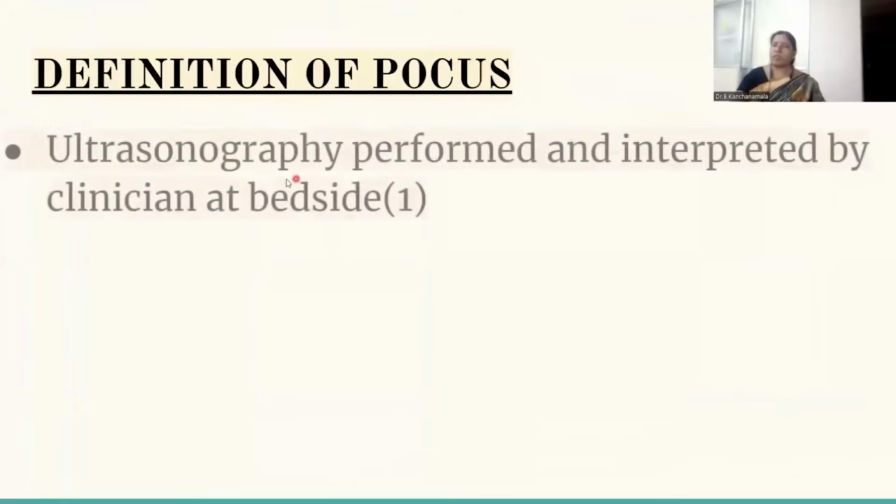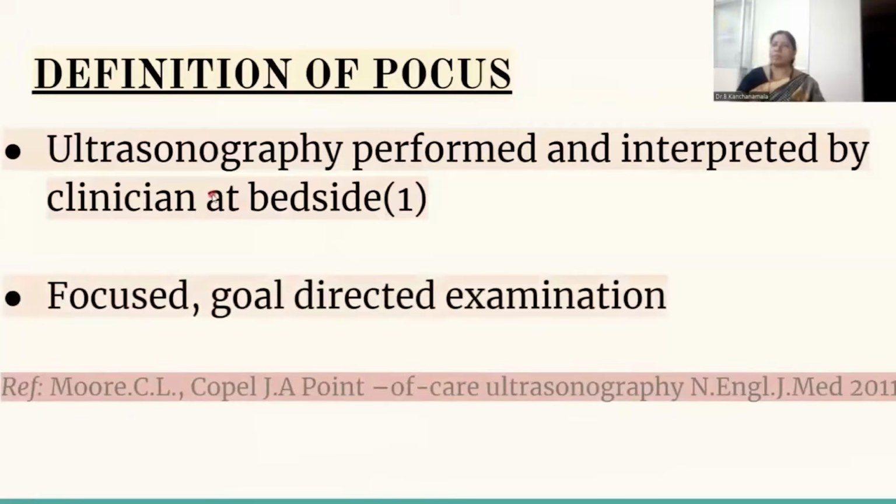So how do you define POCUS? It is the sonography that is performed and interpreted by the clinician at the bedside, and it is a focused, goal-directed examination.